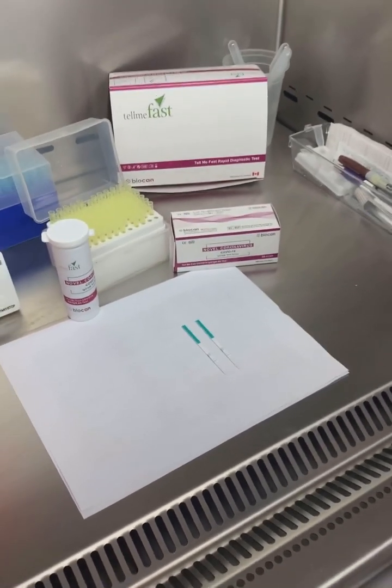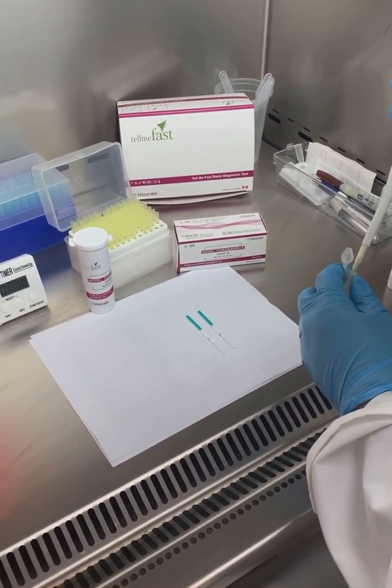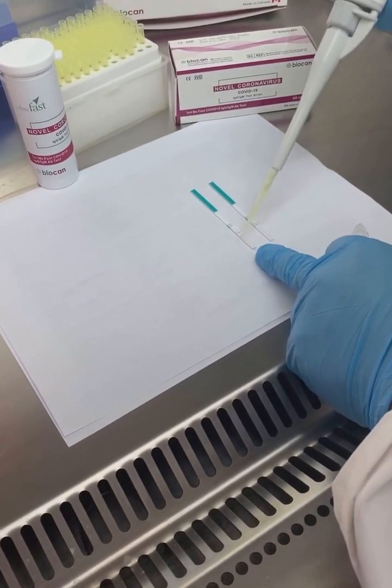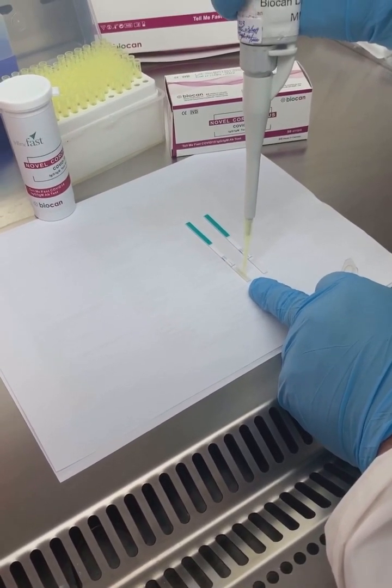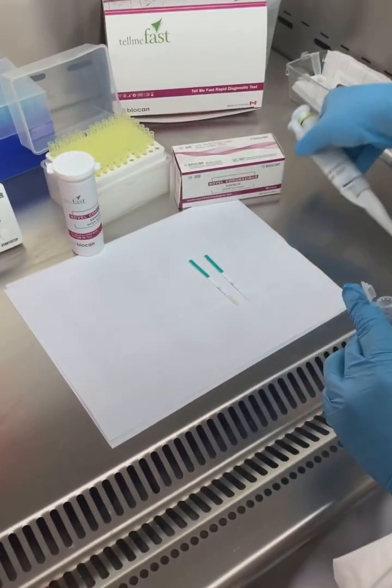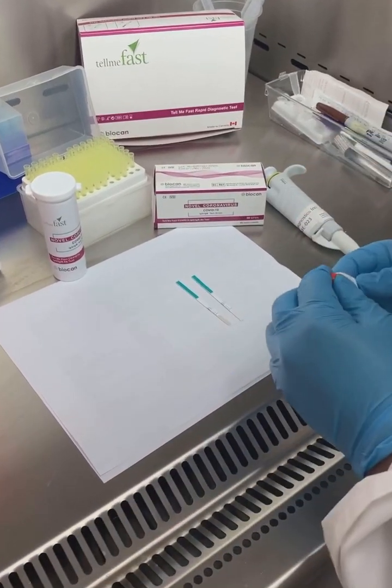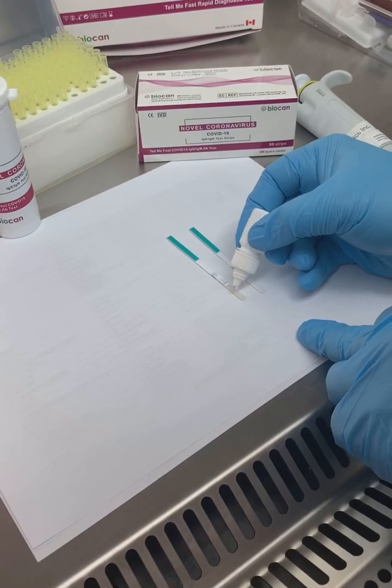We're going to be performing the test using serum. Pipette 10 microliters of serum plasma onto the sample pad of the test strip. Then add two drops of the buffer onto the sample pad of the test strip.